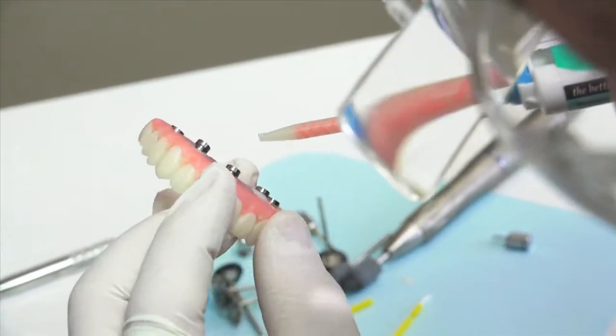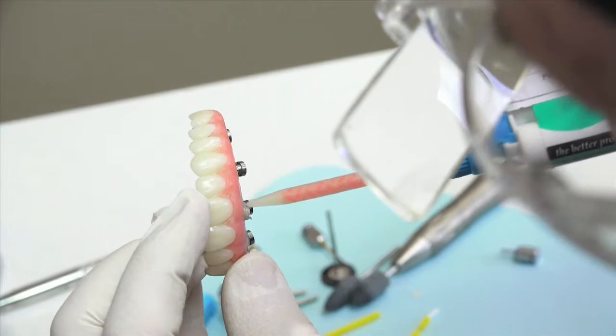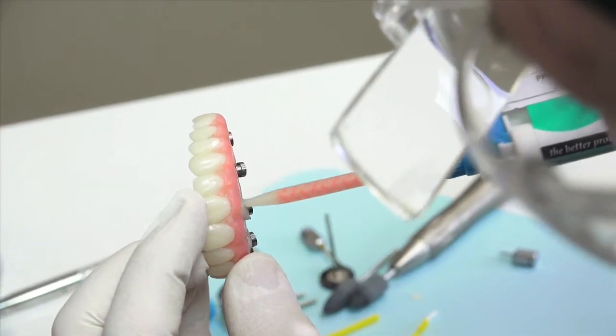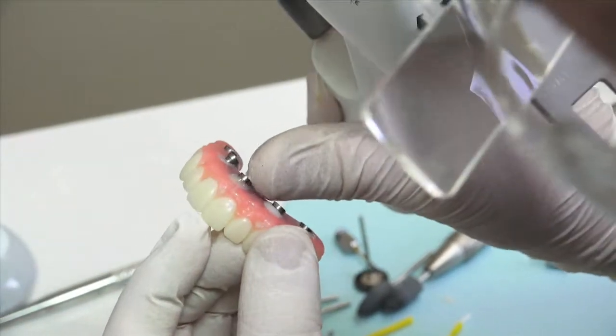Please keep in mind that while this process of finalizing the long-term provisional is taking place, the surgical clinician is typically bone grafting if needed and suturing the patient in preparation for receiving the new provisional.